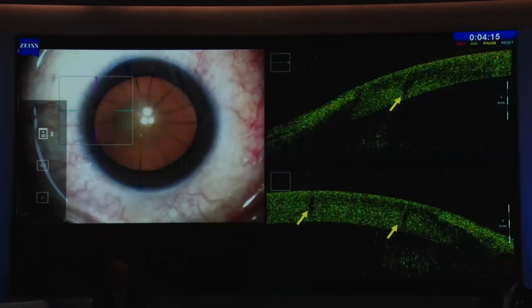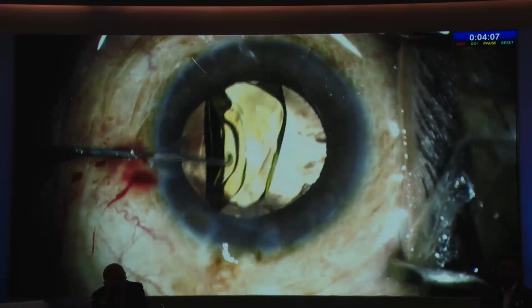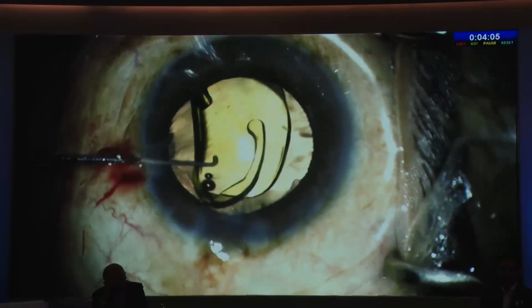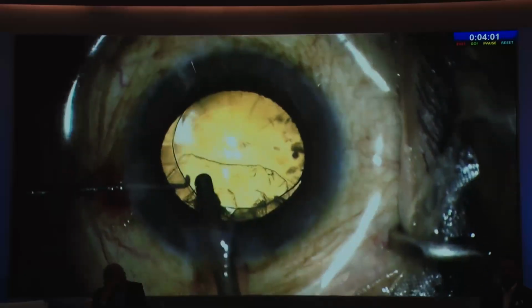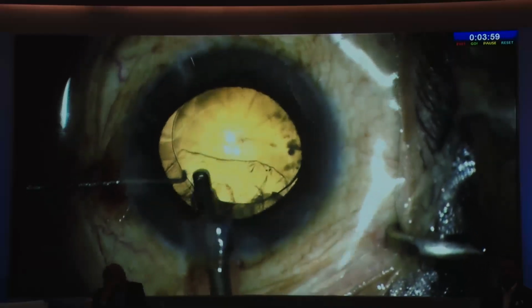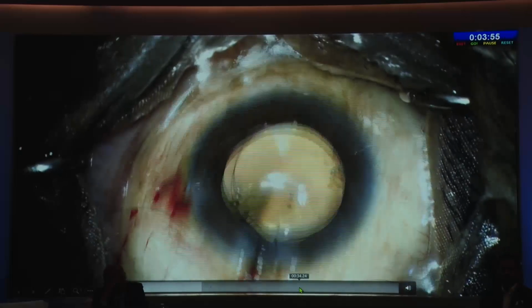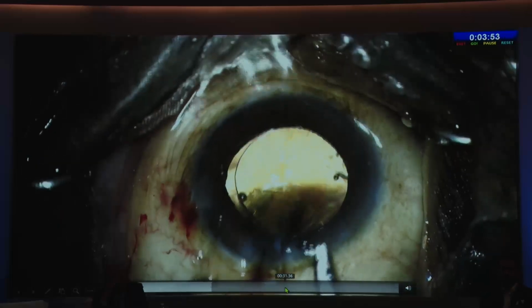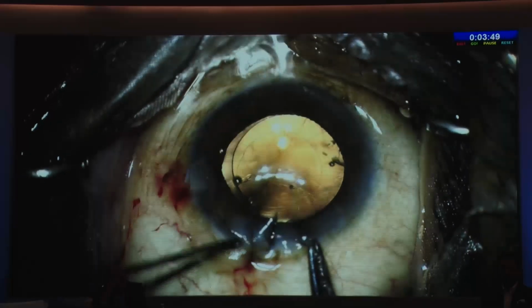So intraop OCT is useful here also because you can see the depth of RK incisions and if they are at risk of opening up. Just a case to highlight that while we were injecting the IOL, the RK incision opened, and in this case you first suture the main wound and then suture the RK incision as well. Because the fluid is going to continuously leak otherwise, so it becomes like a perforation repair intra-op, but then optimal outcomes can be achieved if you manage it timely.